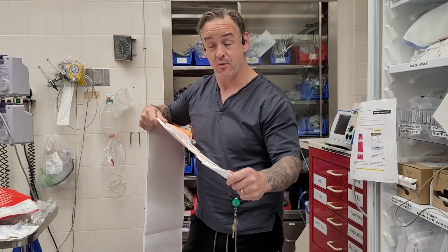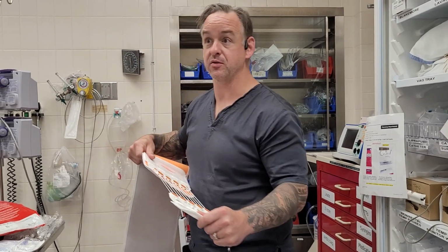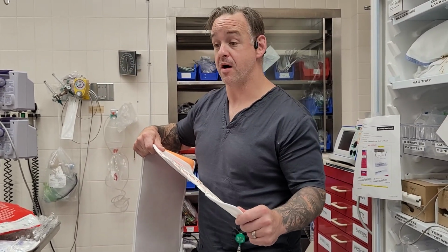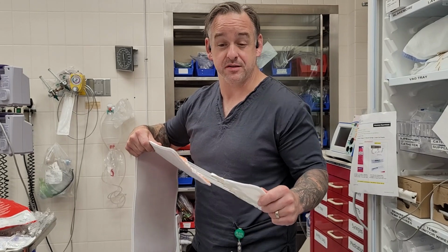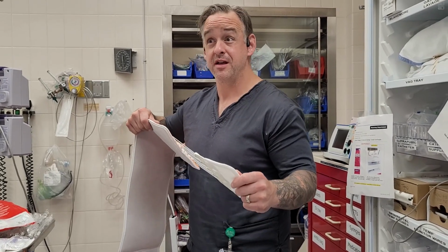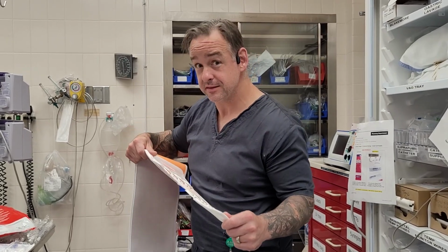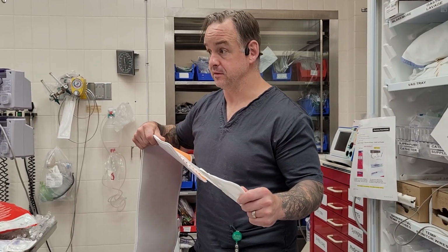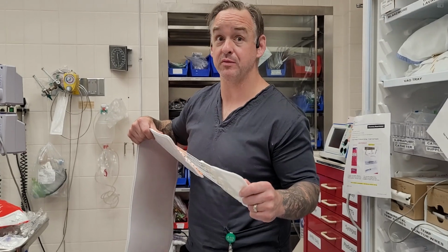In an ideal scenario, when you have a trauma coming in, you know they're coming in, and you know there's a potential pelvic injury, having this on the bed before the patient comes is going to be very useful. Otherwise, we're going to have to apply it to the patient. Anytime a patient has a multi-system trauma, so your ATV accidents, your car accidents, major falls, that sort of thing, pelvic injuries should be high on your suspicions list. Pelvic fractures are probably one of the major sources of people bleeding to death. So it's very important that we stabilize the pelvis if we suspect pelvic injuries.